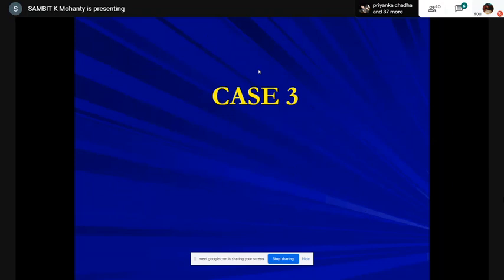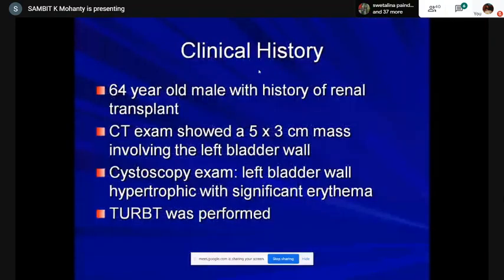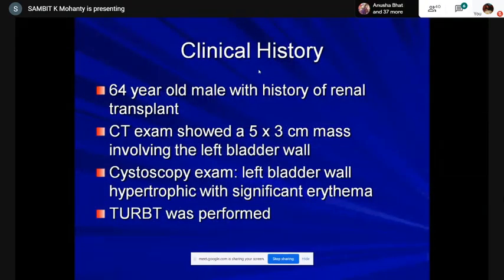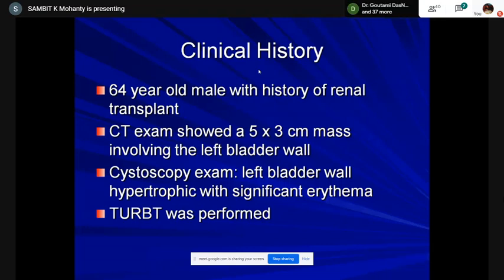Case three: a 64-year-old patient with a history of renal transplant, post-transplant workup. CT exam showed a five-by-three centimeter mass involving the left bladder wall. Cystoscopy showed left bladder wall hypertrophy without a specific mass — more like hypertrophy with a smooth contour elevation of five centimeters, non-pedunculated with erythema at TURBT.